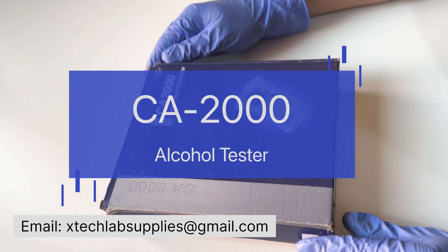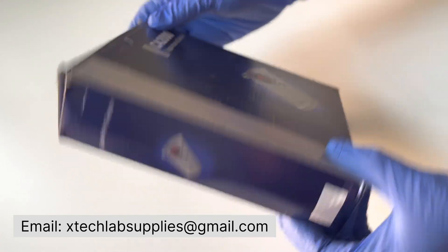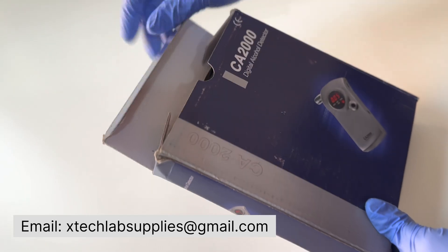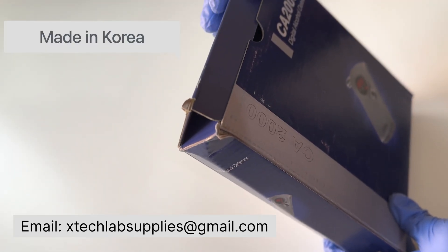Hello and welcome to Extech lab supplies. Today we are doing a quick product demo of the CA 2000 alcohol tester. The country of origin for this instrument is Korea.